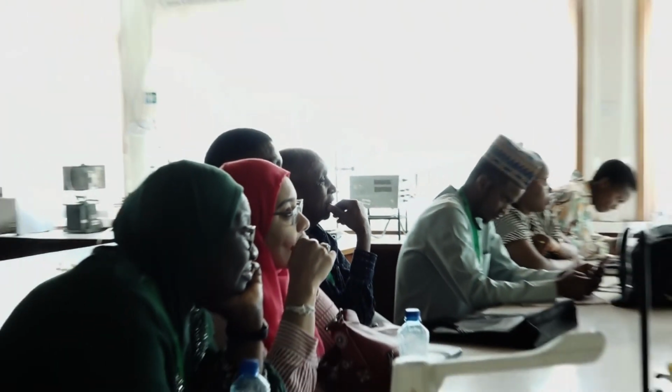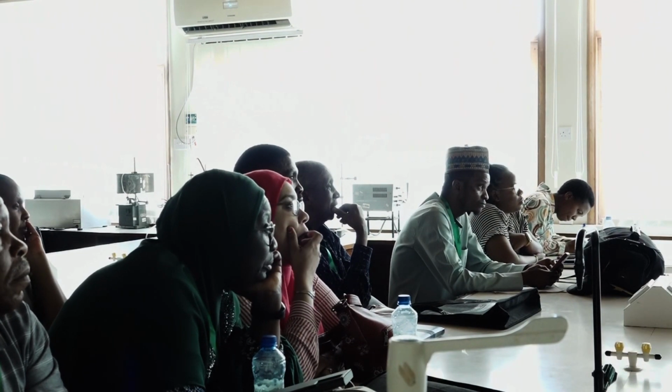And that one, the QRS complex, the S is much deeper. Compared to normal, the S is different here. Normally it doesn't go down that deep.